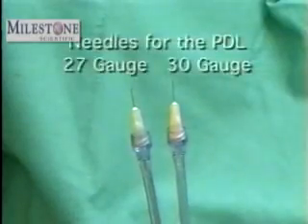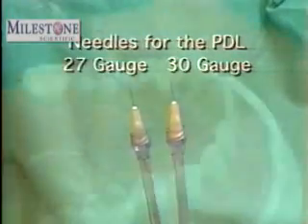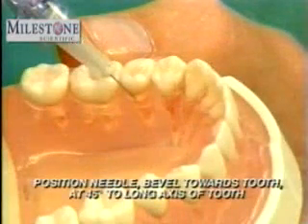The first consideration is the needle. In dentistry, we have a variety of needles available, the 25 long and short, the 27 long and short, and the 30 gauge short. For the PDL injection, the preferred needle is either the 30 gauge short or the 27 gauge short. Site selection is an important factor in success of the PDL injection.